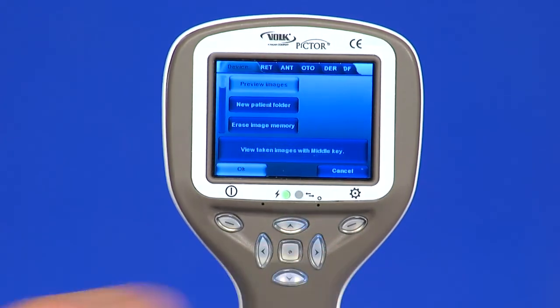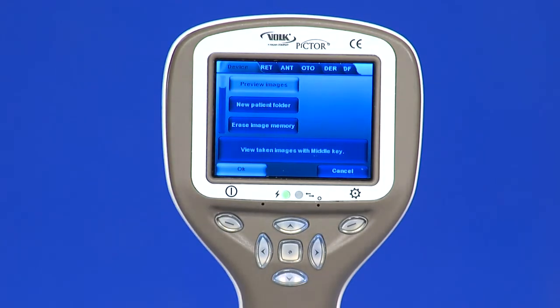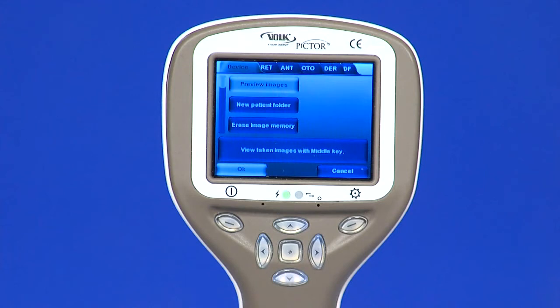Let's run through the device settings in the menu. Preview images: image preview is opened by selecting preview files with the middle key. Patient folders and images are browsed by using the arrow keys. Display gives information about usage of the image preview. Resolution of the image preview is rather small. Preview is intended only for a quick check that all necessary information is captured.